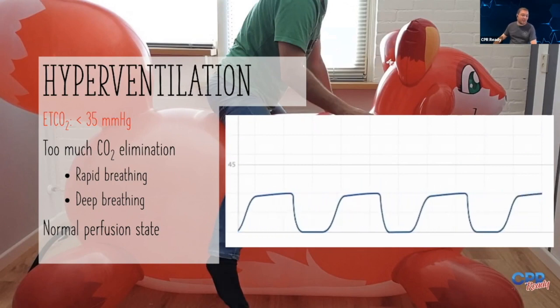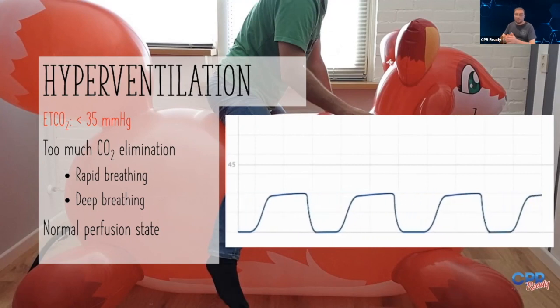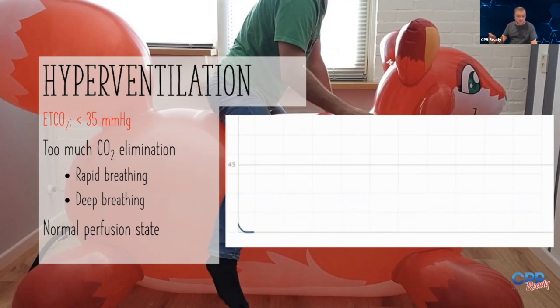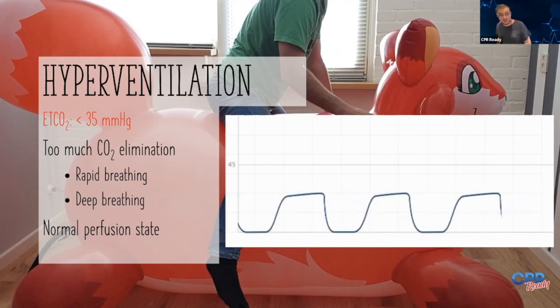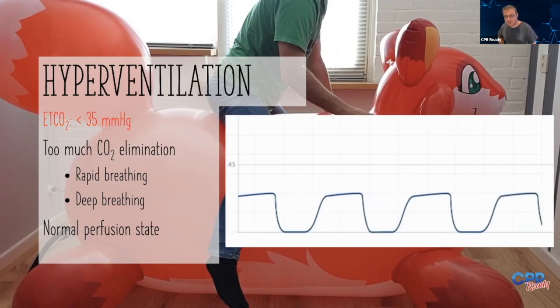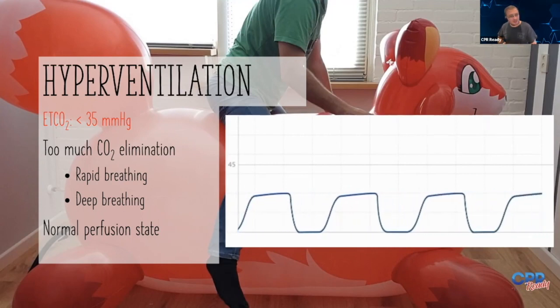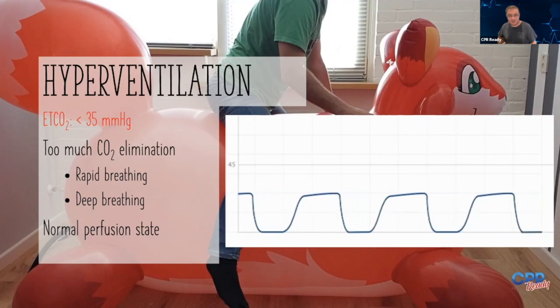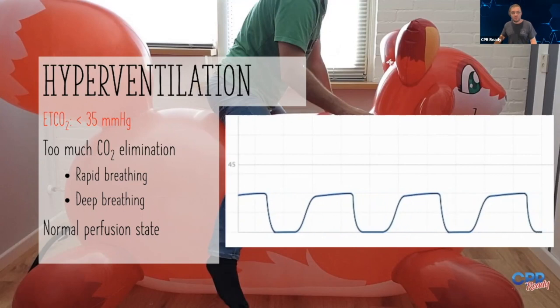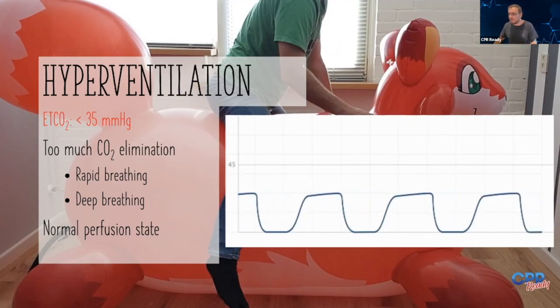And sometimes you can have deep and rapid breathing in a combination. So it can be low for a bunch of other reasons too, and we're going to talk about that. But remember, CO2 gets produced through cellular work, through perfusion. So if you have a low end-tidal CO2, but you have what appears to be relatively normal breathing, then you have to ask yourself, what's causing it to be low? Is it just because they're hyperventilating, or are they simply not producing the CO2? And there's another problem there. So don't just assume low end-tidal CO2 is a lung problem. It could be something different. We'll talk about that in a little bit.